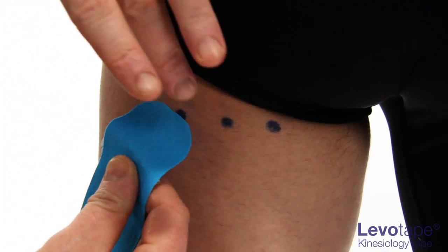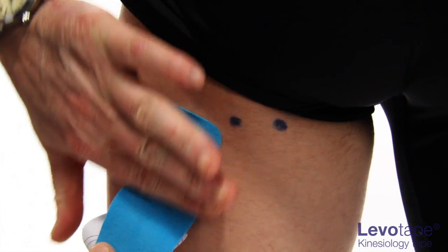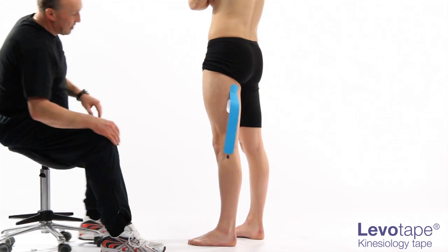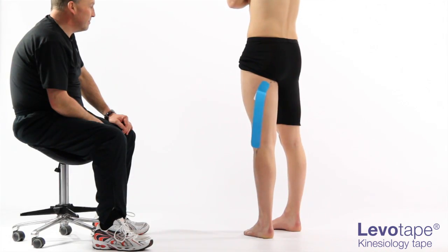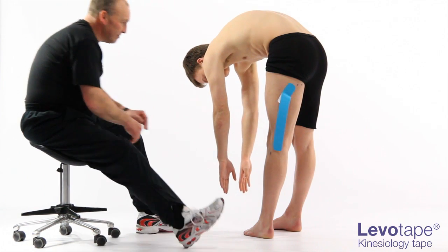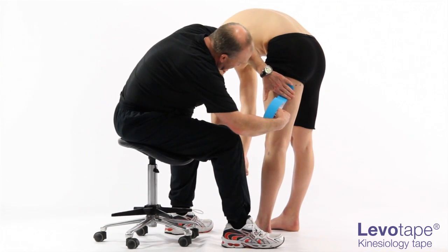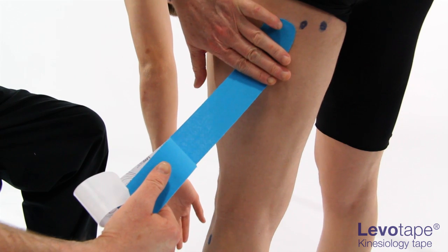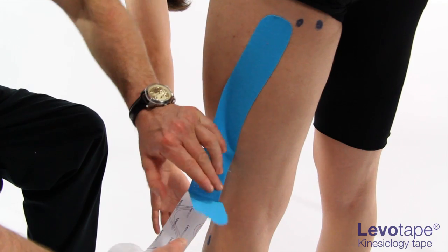First, apply the I strip. Lay down 3 to 4 centimeters of tape as an anchor at the base. Instruct the patient to internally rotate the hip joint. Flex forward at the hip, maintaining full knee extension. Lay the I strip down along the outermost edge of the biceps femoris, ending at the head of the fibula with absolutely no tension.